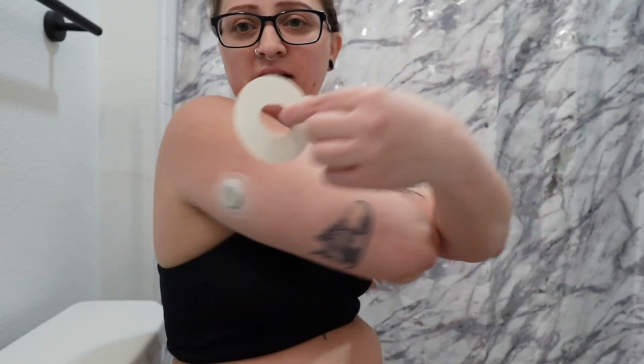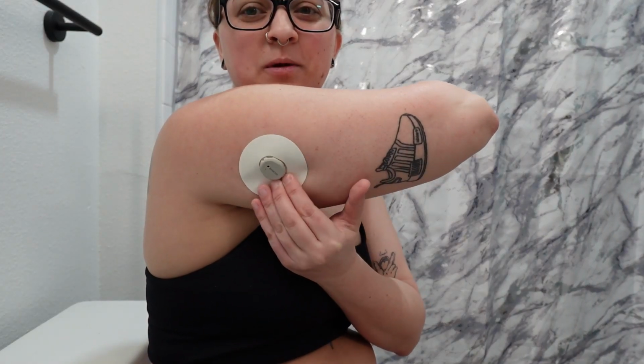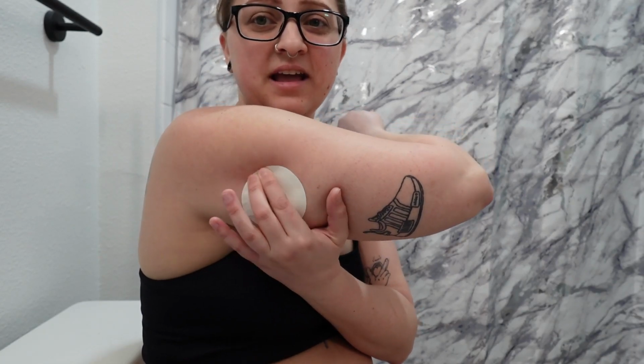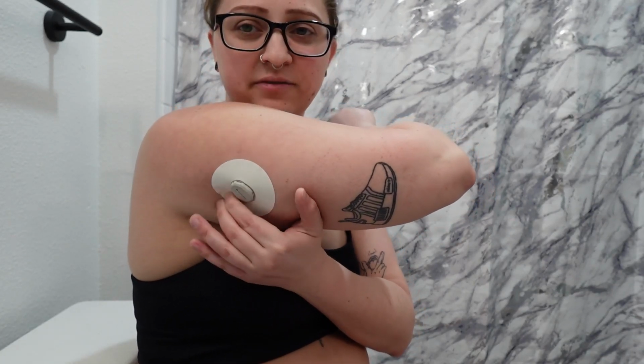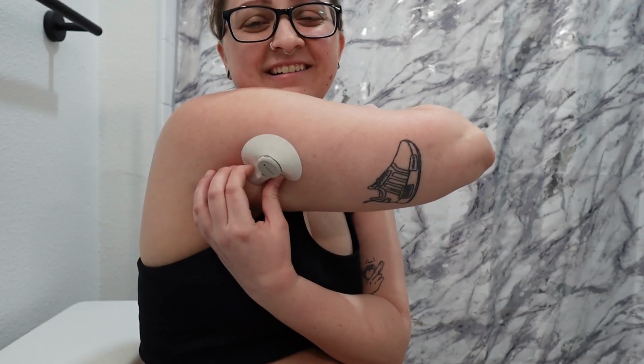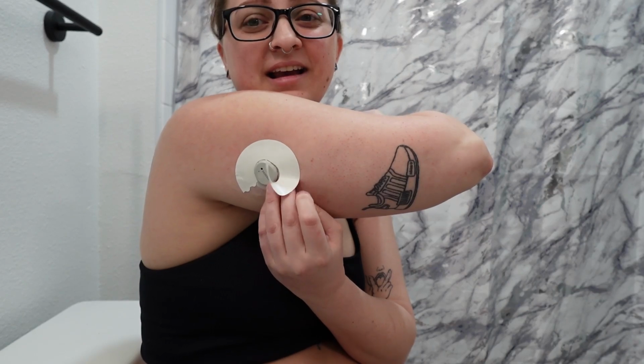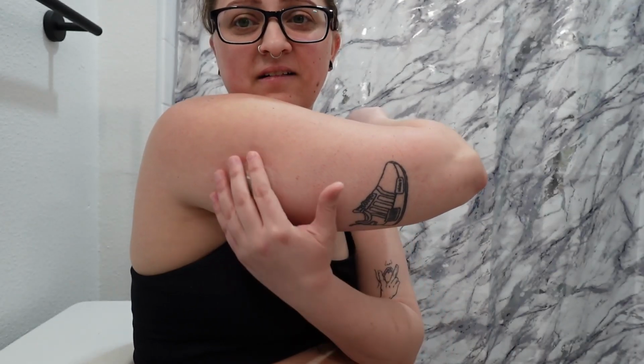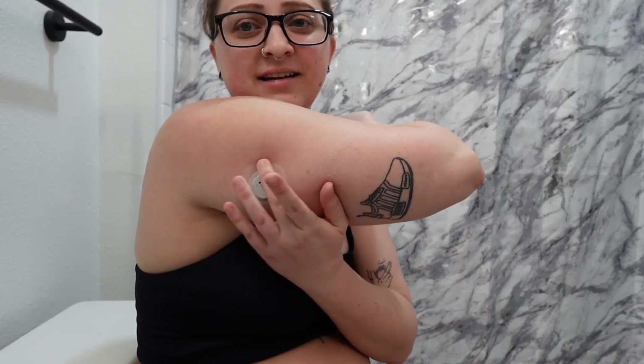Ah, she's so cute. Okay, I'm gonna go ahead and take her off, and I'm gonna go ahead and line her up, because if you guys can't tell, one portion is bigger than the other. I have to use a mirror to line it up, but once I line it up, I'm good. So we're just gonna go ahead and do the same thing. It says 3, I do 5 because why not? Okay, and then we'll go ahead and slowly but surely take it all off and then just give it a nice 3 times over again, and we're good.